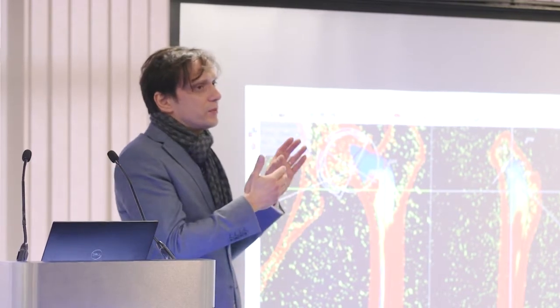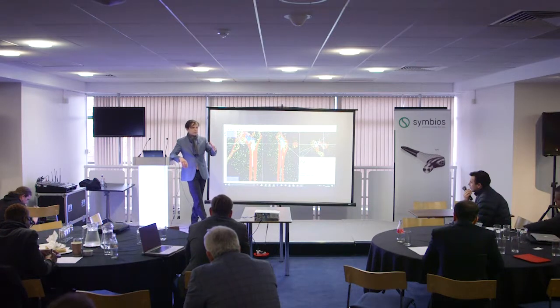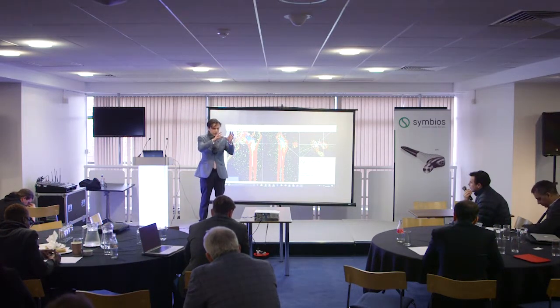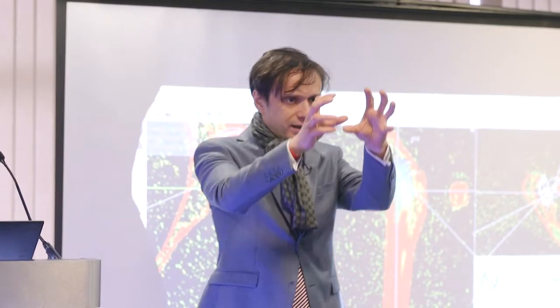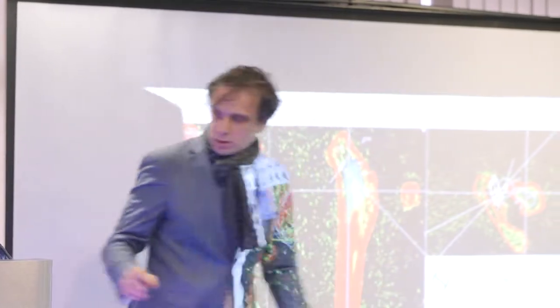If, for example, we need to lengthen the limb, it means that maybe there is a wear that put the hip slightly subdislocated laterally. So it means that we have to do this and this to put it right again. This is what we call here.